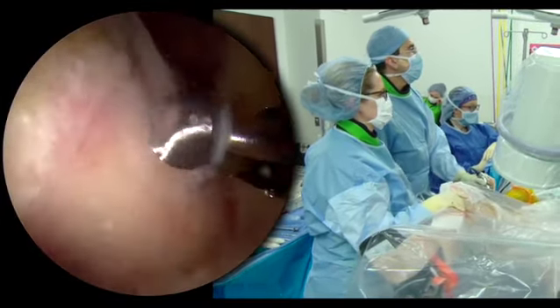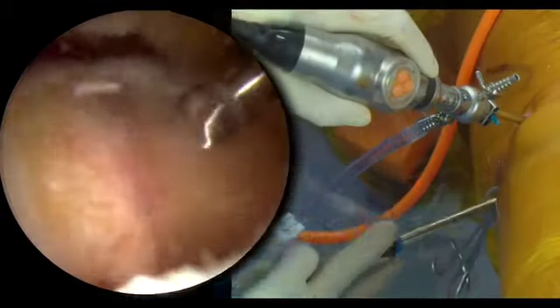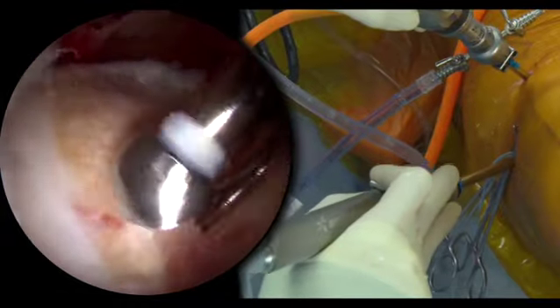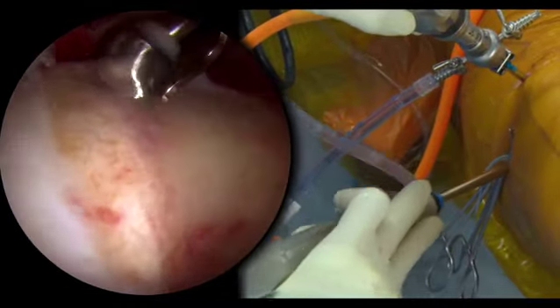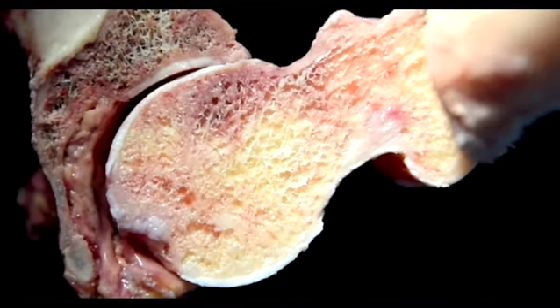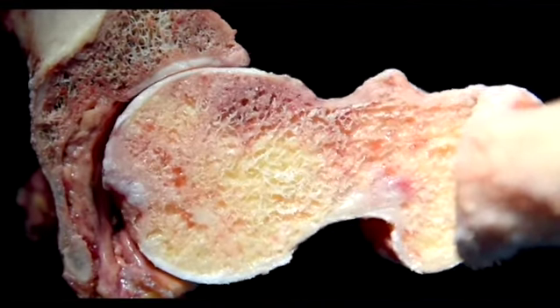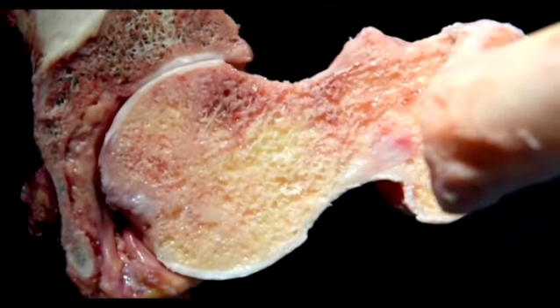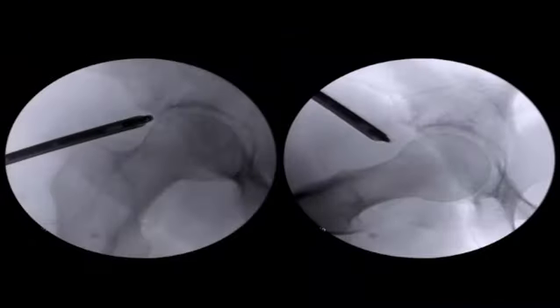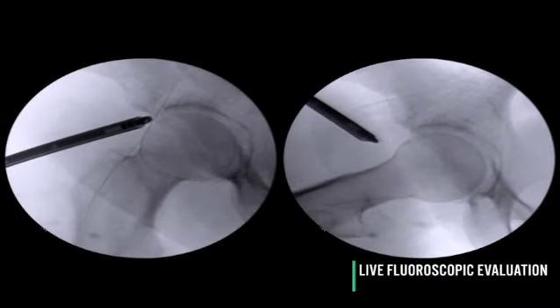The burr can be used in reverse at this point to smooth out the edges of the bone and create a smooth transition between the femoral head and the femoral neck. As you can see in this cadaveric demonstration, there is significant friction between the cam and the cartilage and the labrum, but when the cam has been resected, there's frictionless motion in this hip, which has returned to be concentric again.